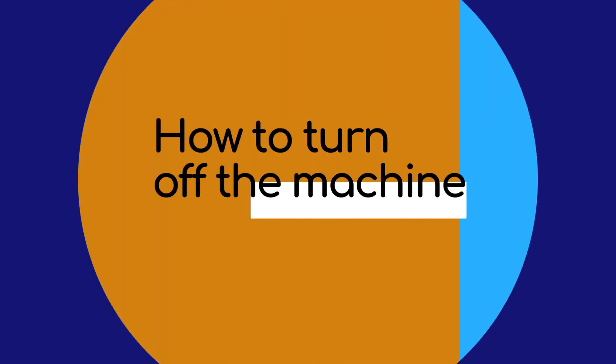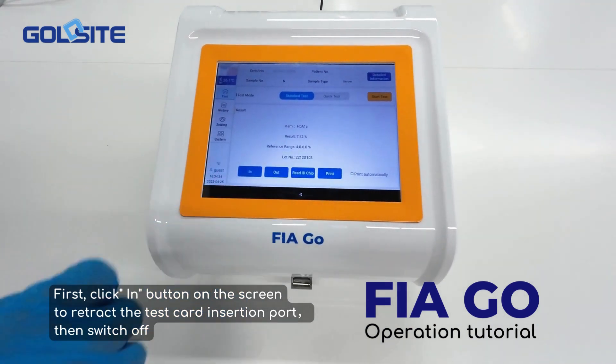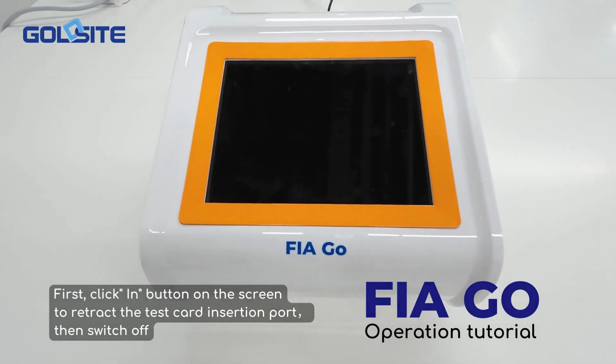To turn off the machine, first click the button on the screen to retract the test card insertion port, then switch off.